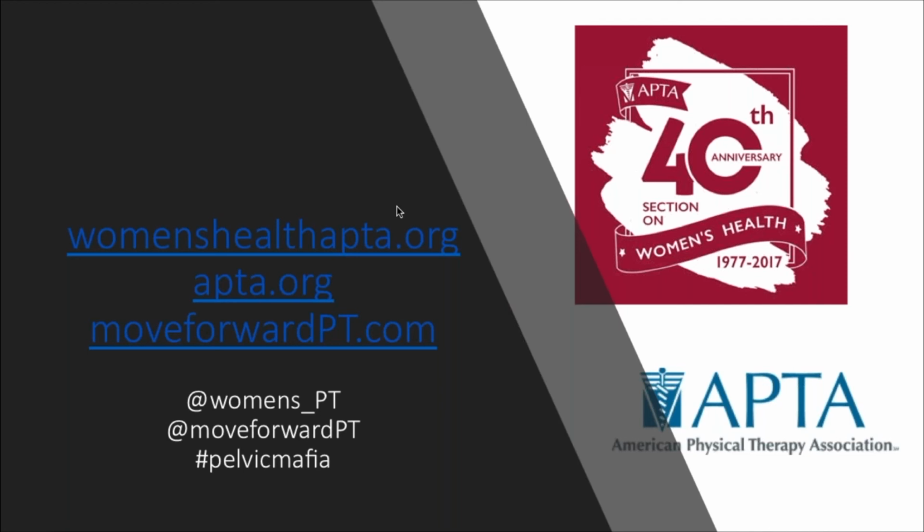Sometimes if they've had multiple cesarean sections and you have a lot of scar tissue immediately superior to the symphysis where you're positioning the transducer, it may make for an image that's not beneficial. You may get a little bit of information out, but it may not translate well enough to the patient to make a difference for them from a feedback perspective.